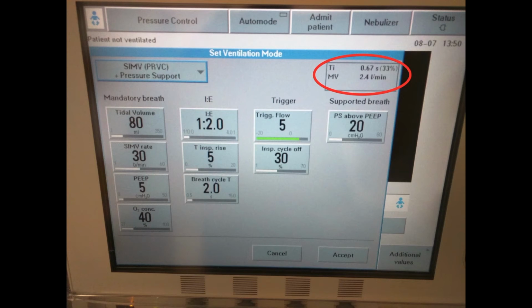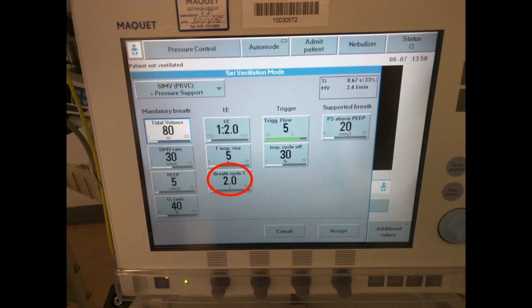Likewise, if you've set the inspiratory time too long for your patient, it limits the time for expiration, limits the respiratory rate, and puts the patient at risk of hypercapnia. One of the places we will tend to use long inspiratory times is with patients with lung injury, ARDS, where we're using a high PEEP and long inspiratory time, trying to keep the lungs open as best we can. But again, you'll get more on that in the next podcast on ventilation.